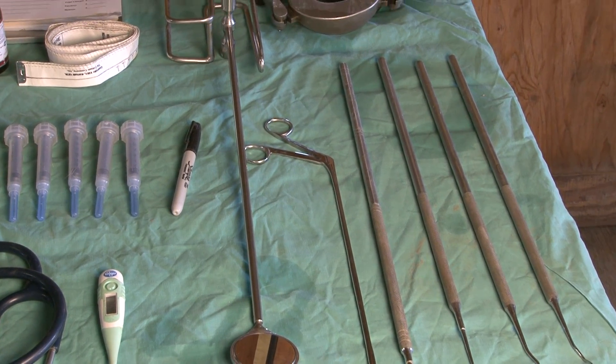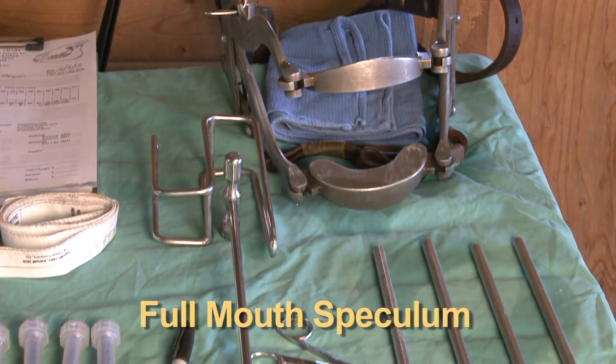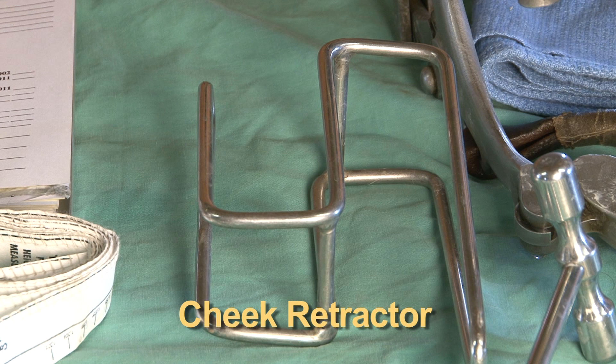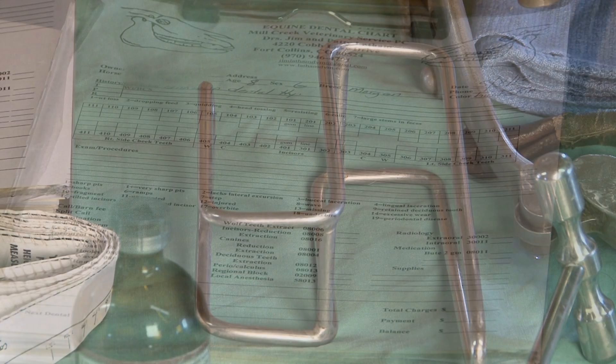On the back side of the table here, we see the full mouth speculum, and just to its left is a cheek retractor, and these instruments are used to give the oral cavity a complete exam.